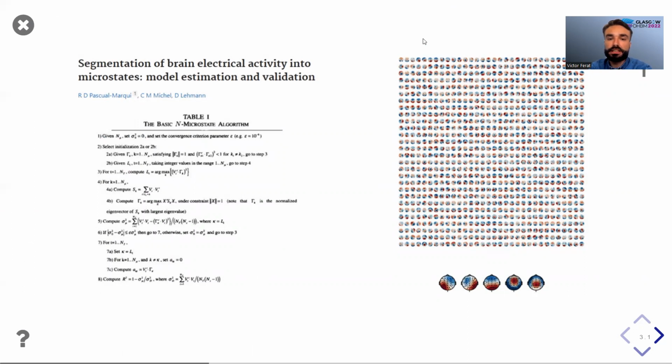This algorithm takes as input an EEG recording, or if we look at it in another way, a lot of topographies, and finds the cluster centroids of these topographies. This algorithm ignores the polarity. So there is no difference if we have blue, the less active regions, or red, the more active regions, here, or if we switch the polarity.